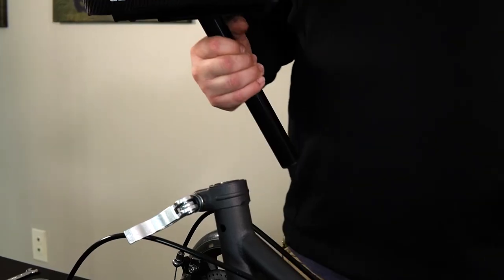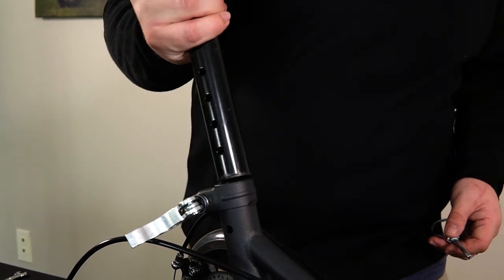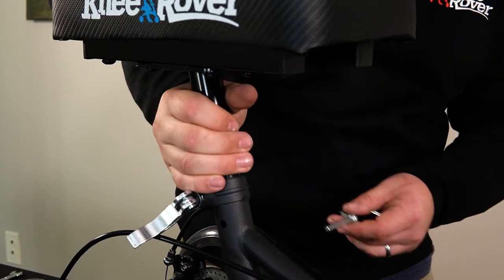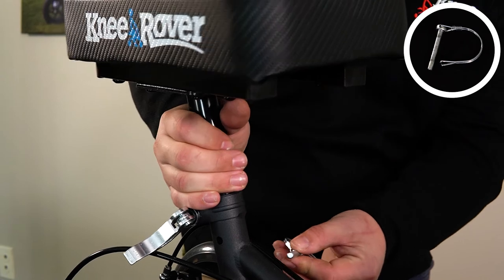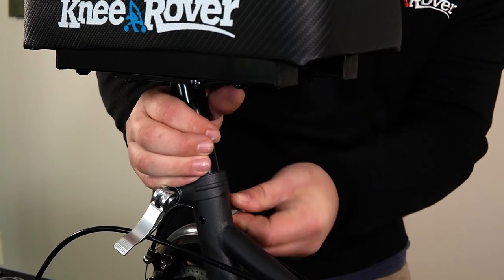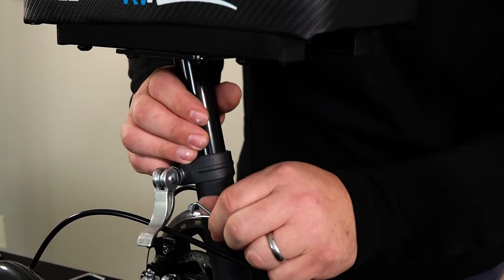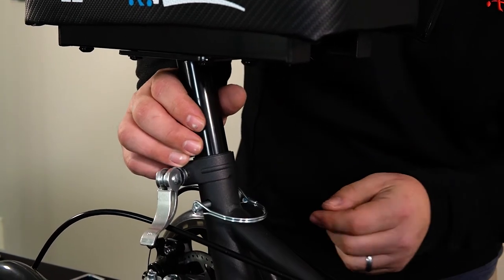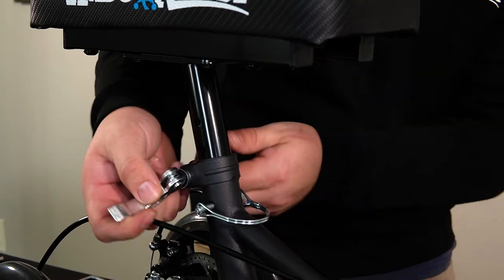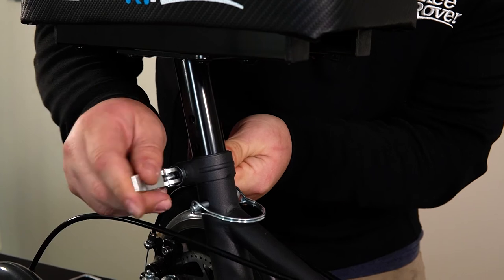Continuing with step number five, we're going to put the knee pad in — we've got it all assembled. Take the knee pad locking pin and put it in the hole at your desired height. Bring it around and secure it there. Then take this quick release lever and just clamp it around.